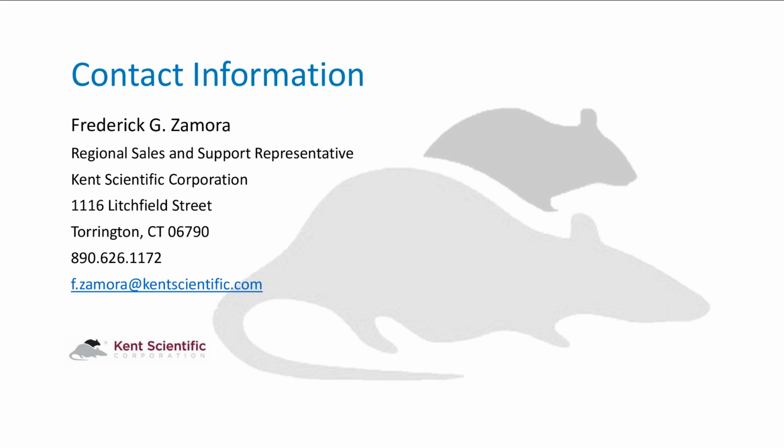Perfect. Next question here is the wait time for ISO to reach the induction chamber wasn't addressed. Is that variable, or is it always about 5 to 10 minutes? Hello, Deborah. Nice to see you.